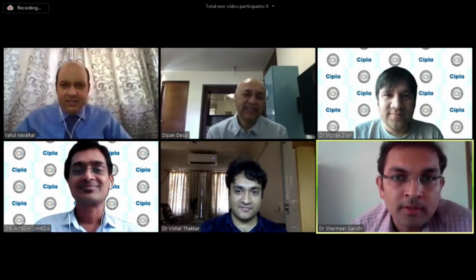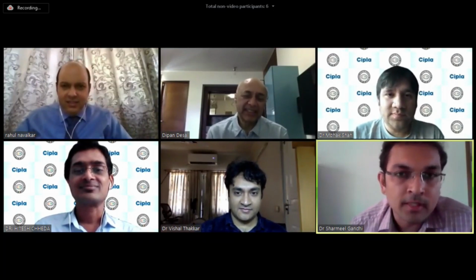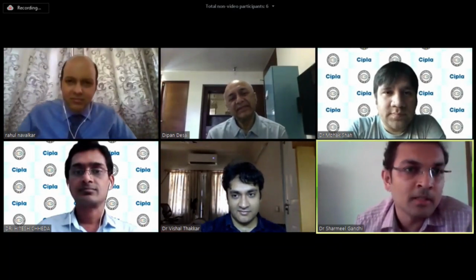But sir, one point. There's research going on in the modification of IOLs with a femtosecond laser. Yes, right. So I think femtosecond is of course going to stay, but many things are going to come, and after that all the formulas and everything would change, because we will put in a zero diopter lens and then modify it with the femtosecond laser. So femtosecond will of course come, and once it becomes cheaper, we all can buy it.